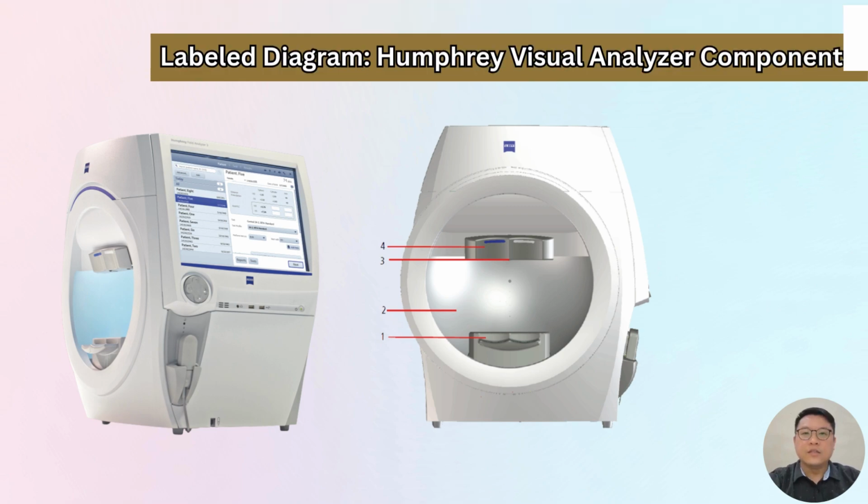This is the labeled diagram of the Humphrey Visual Analyzer. First, the chin rest, located at the lower front of the machine, supports the patient's chin to keep the head steady and in the correct position during the test. This stability is essential for accurate measurement.